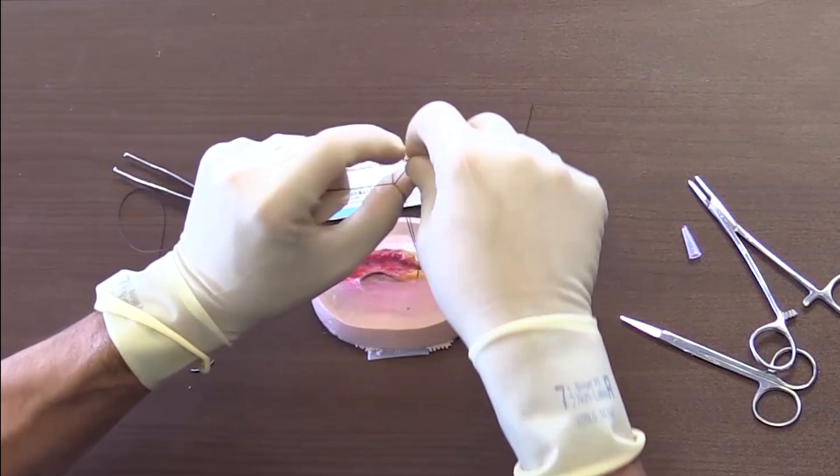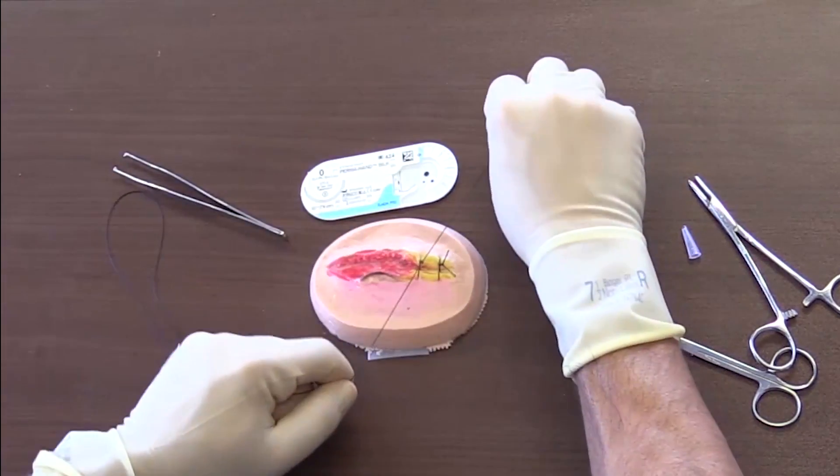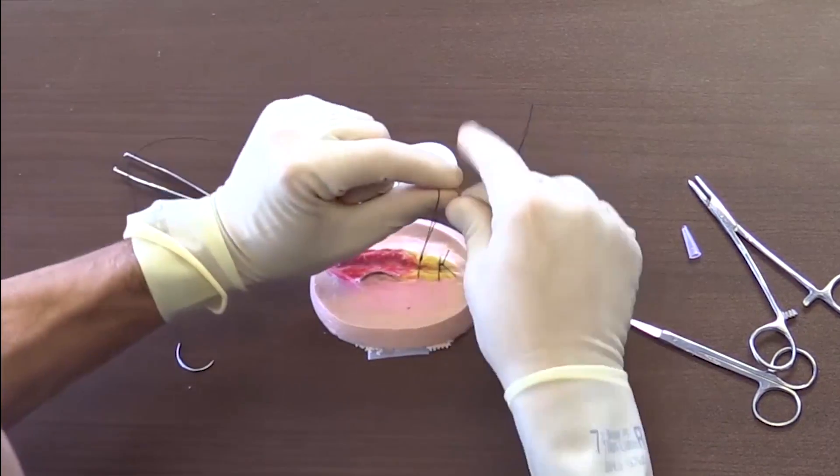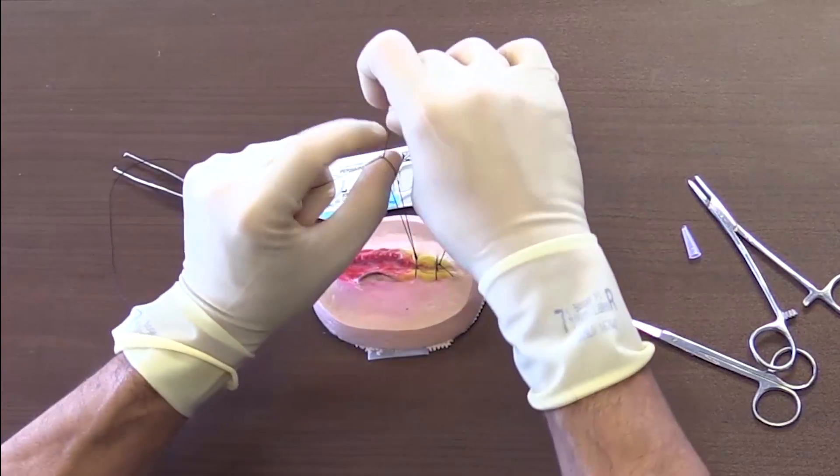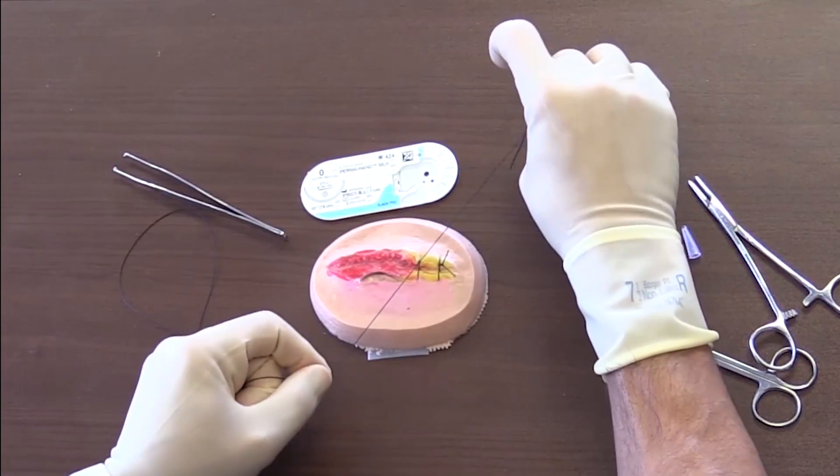Just kind of looping it, and then you want to cross hands. So this is your two-handed tie.